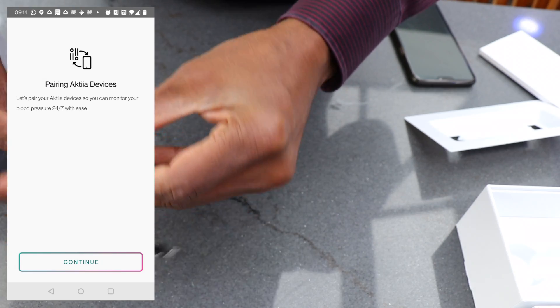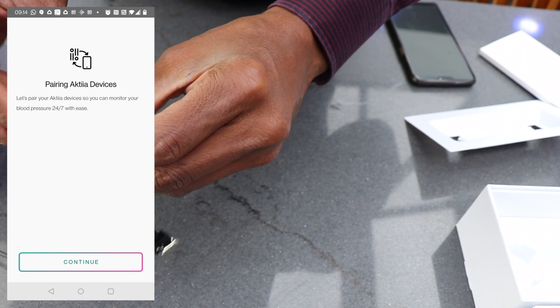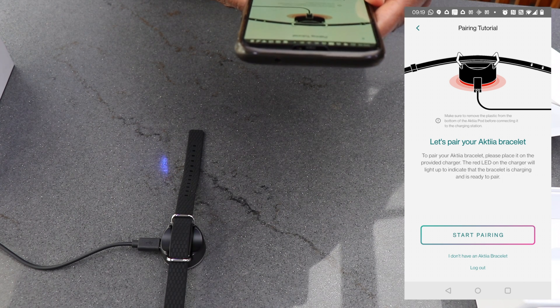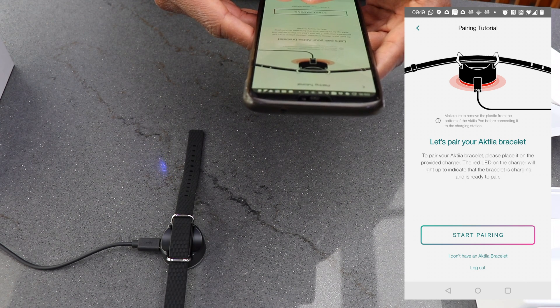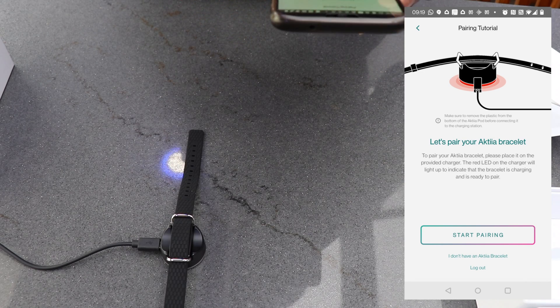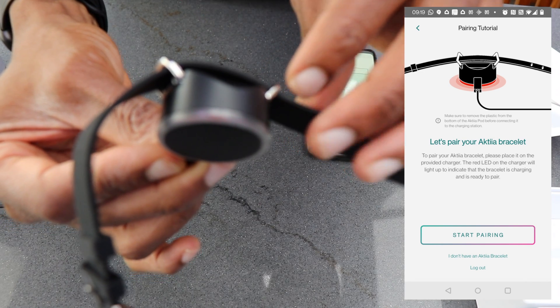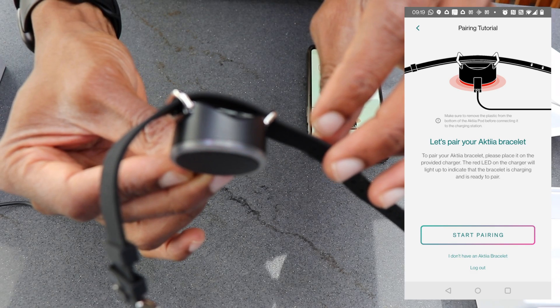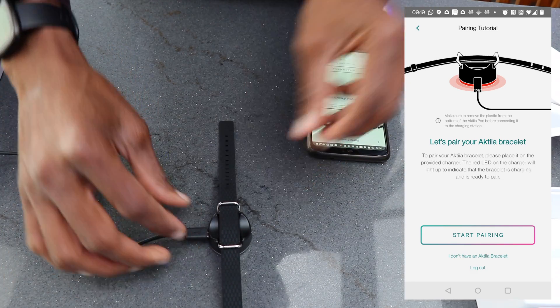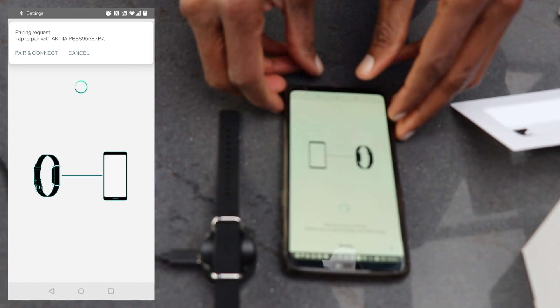To pair the wristband with the app you need to place the wristband on the connected charger. The base of the charger will be flashing in red once the wristband has made connection with the charger. Then we start pairing.